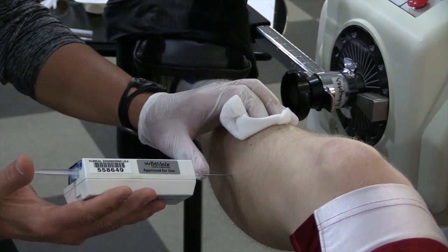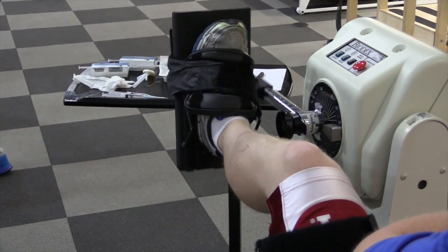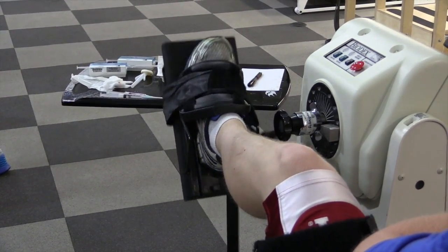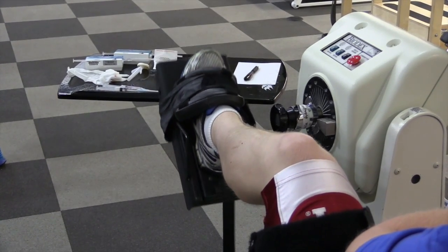The patient is then placed in the Biodex machine and will undertake a five-minute course of resisted dorsiflexion and plantarflexion, exercising these compartments individually.